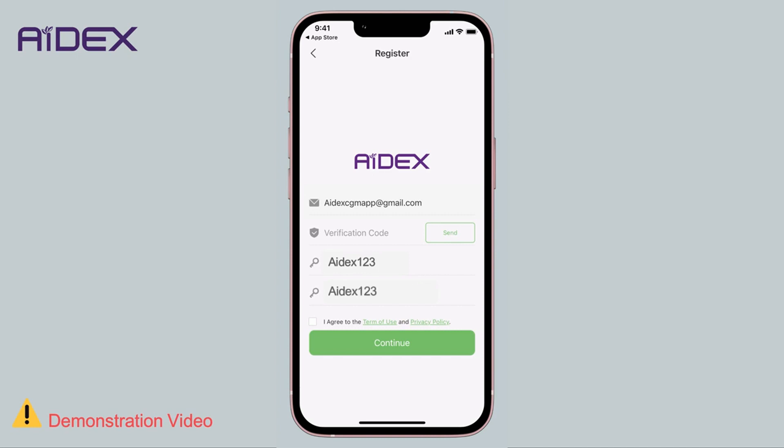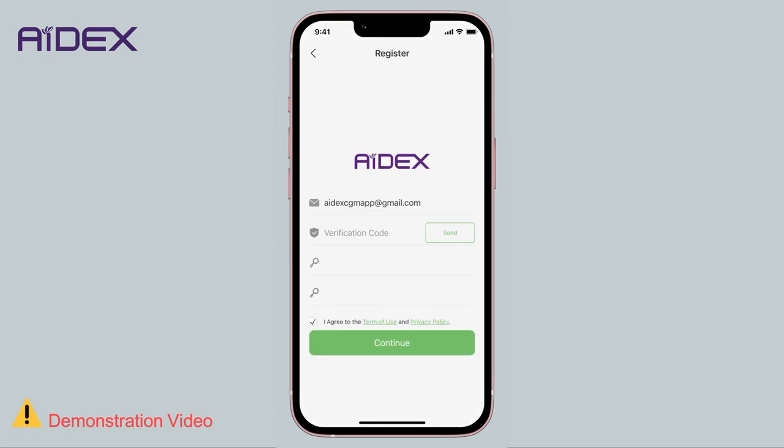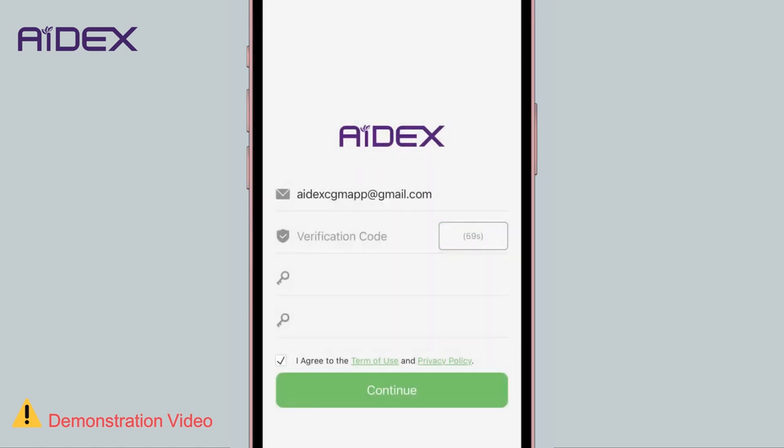Re-enter the same password. Check the box to agree to the Terms of Use and Privacy Policy — it is advisable to examine them thoroughly before giving your consent. Finally, click 'Send Verification Code' to your email address, and this should be completed within 60 seconds.